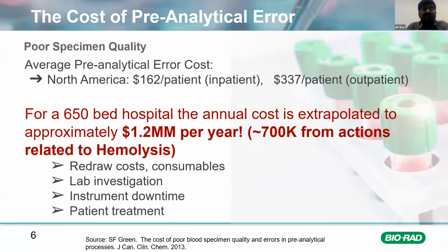This included everything apart from the pre-analytical area, including the costs associated with the redraw of samples and consumables, lab investigation, further instrument downtimes, etc. And of course, patient treatment. All of that considered, it's huge.